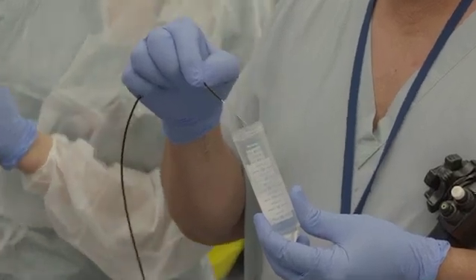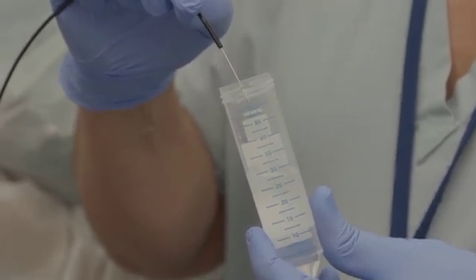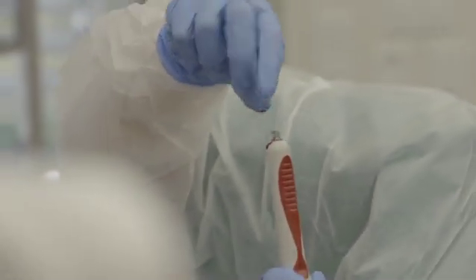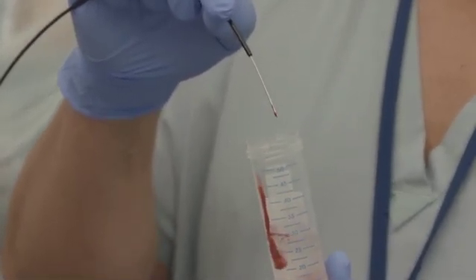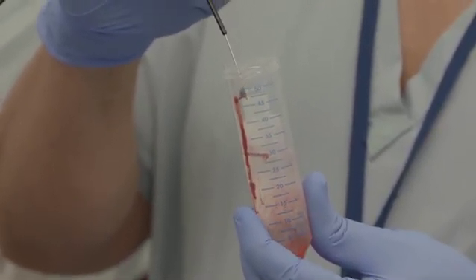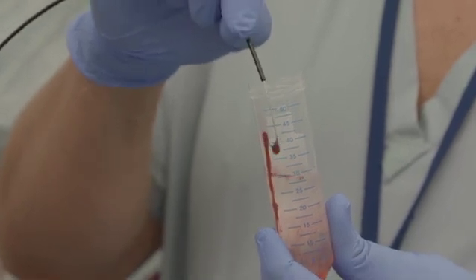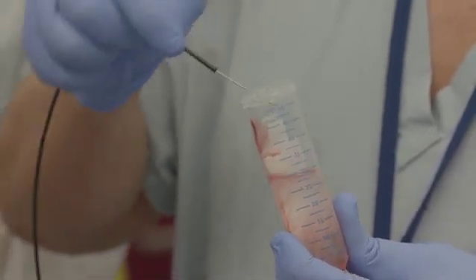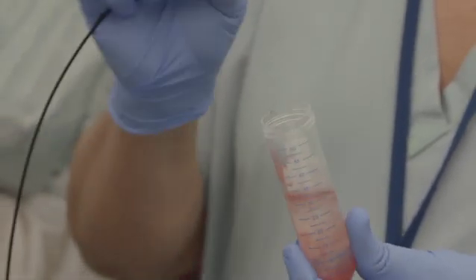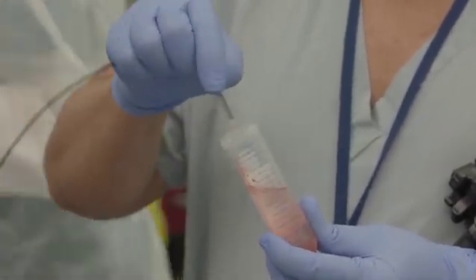Introduce the stylet — you reintroduce the stylet. Push, push, push — and here we have the biopsy. Here again — stop, stop — here we have the biopsy. Push again. This is perfect — a little bit more tissue. You see, this is tissue. We have a real biopsy.